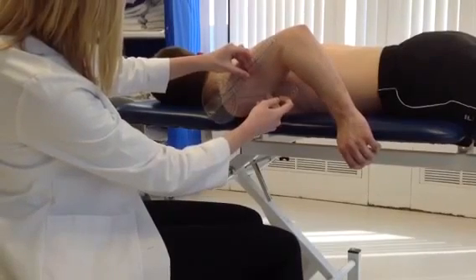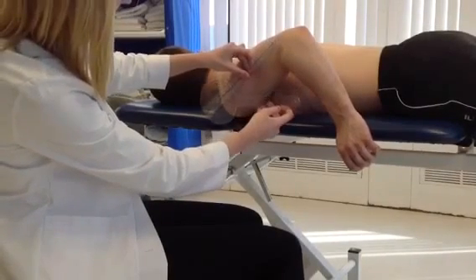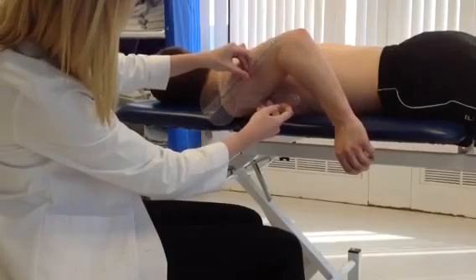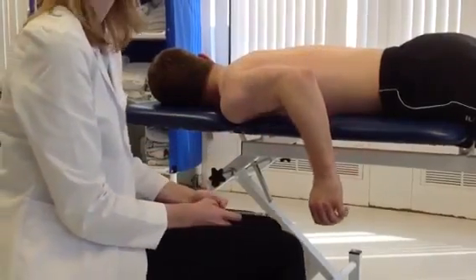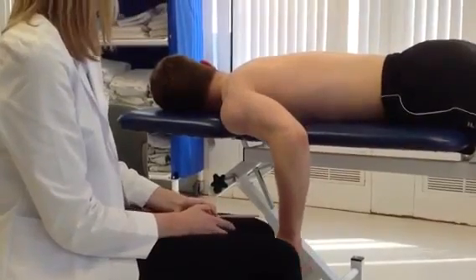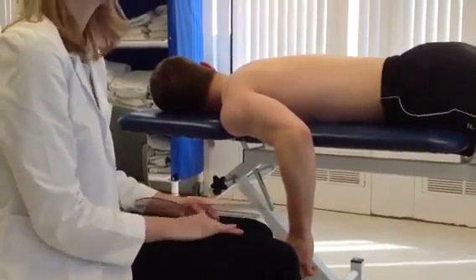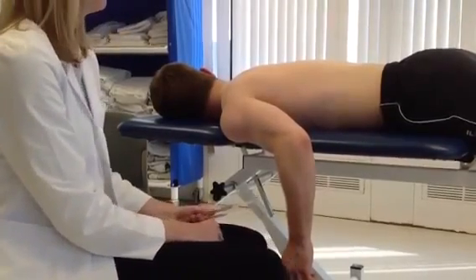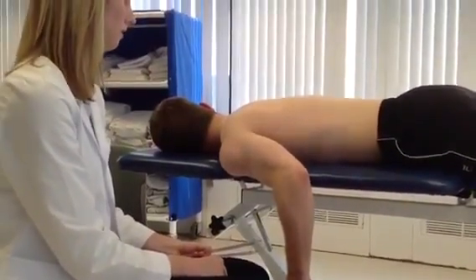Alright, so with the goniometer still lined up, I get a measurement of 36 degrees. And for shoulder complex extension, we typically would expect about 40 to 60 degrees. So maybe a little limited, but pretty close to normal range for that.